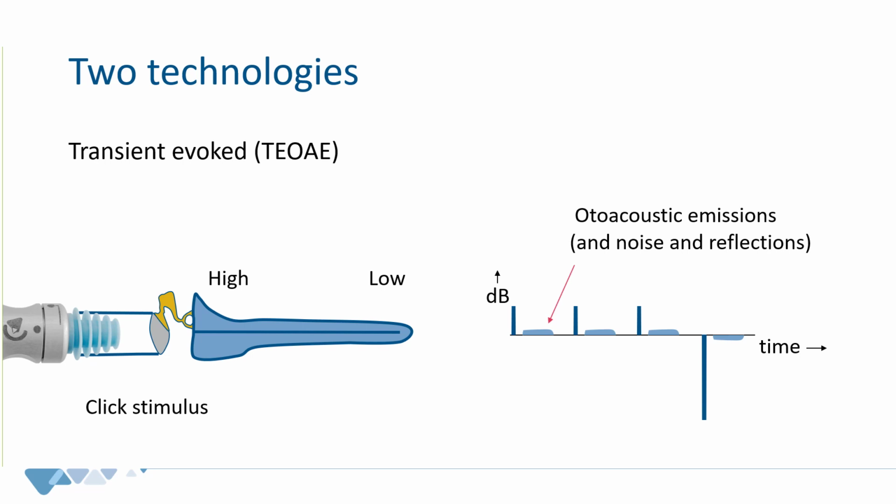This only works if your click is very beautifully shaped, and if there is no distortion between having a small intensity and a larger intensity. And this is also where the limitations of TOAE come into place. It limits the frequency range because of how precisely you can do this. But by repeating a package of such 4 presentations, you can find OAE.